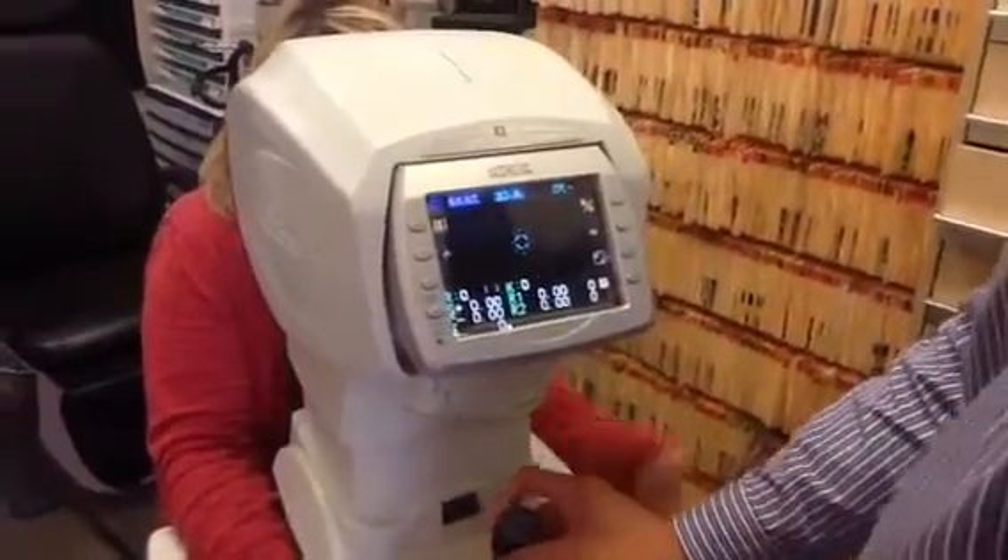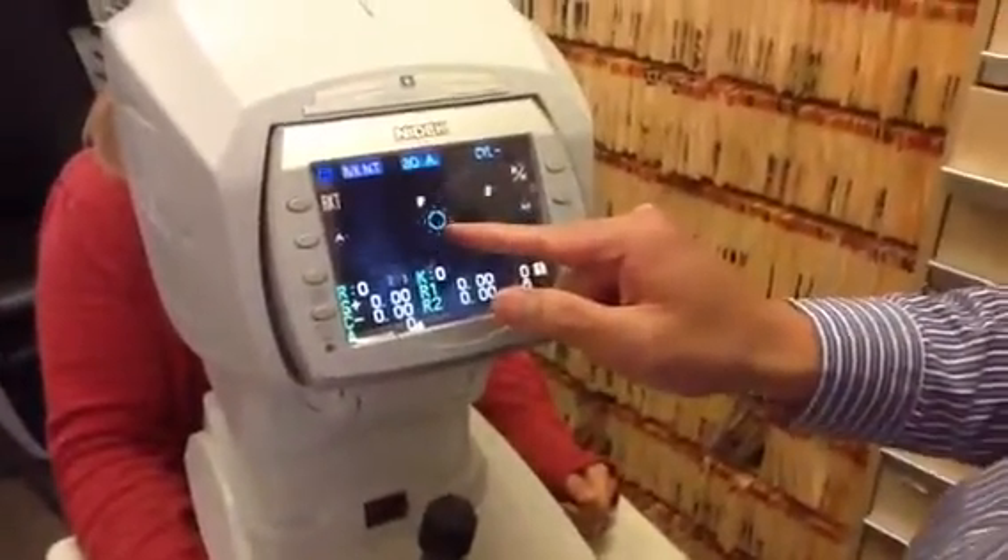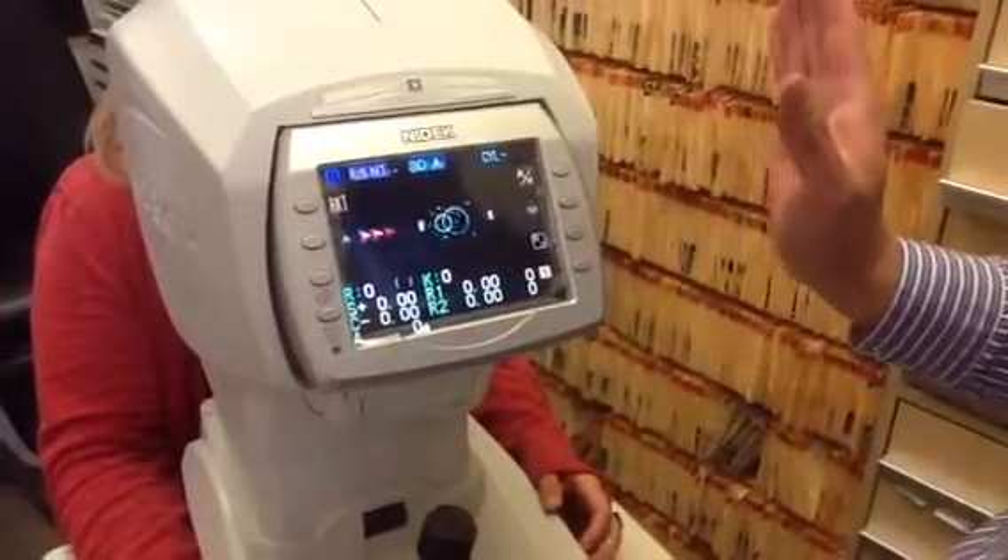With this machine, all you've got to do is just get those markers and the machine will do the work by itself.